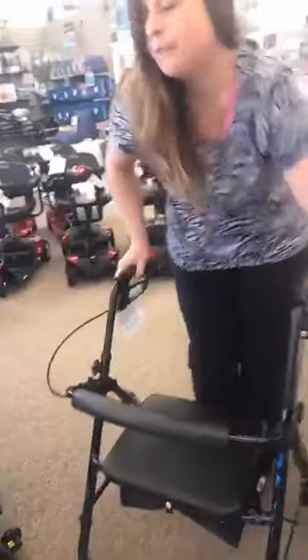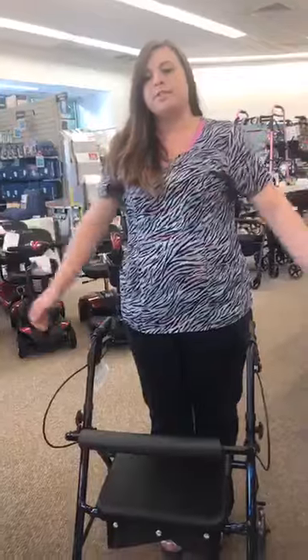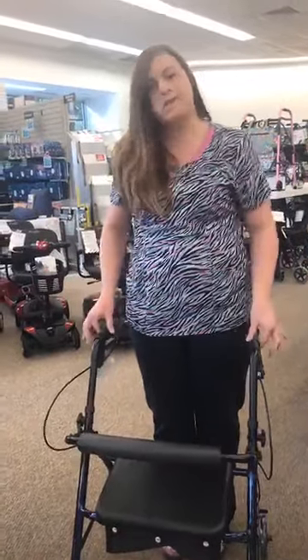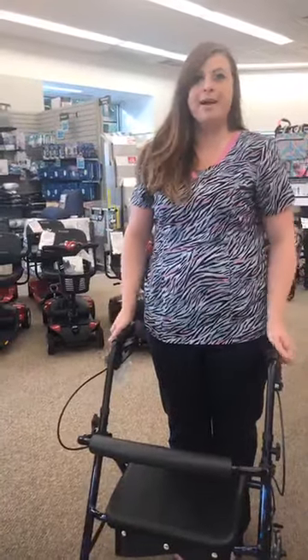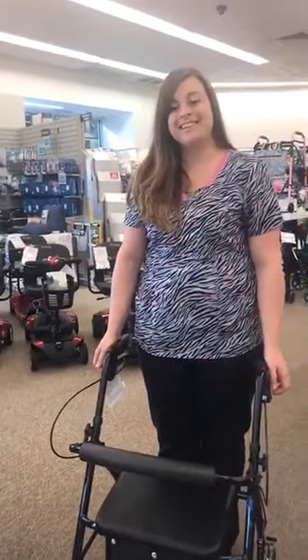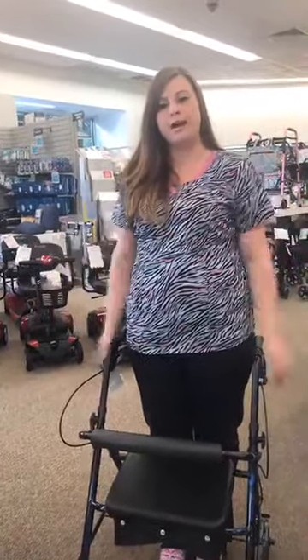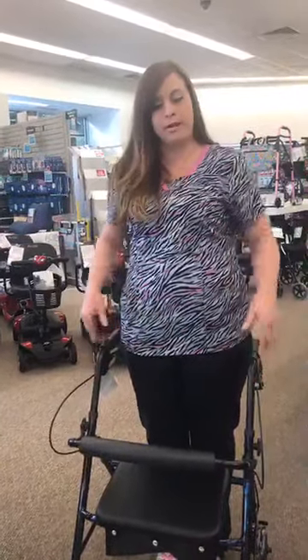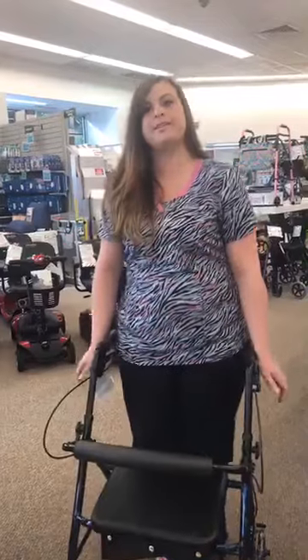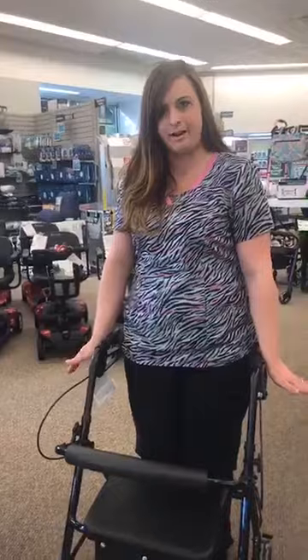So what you want to do is comfortably stand inside of your rollator, and this is the same thing for walkers. When you're standing in your rollator, you want your handlebars to meet you in your wrist area. So this is a little bit too short for me. Excuse that. But anyways, you want to just stand inside of it and relax your arms comfortably to your side. And when you do that, you want to adjust your rollator handlebars to meet you in that wrist area. So if I was about this tall, this would be perfect for me because it's meeting me right in that wrist area.